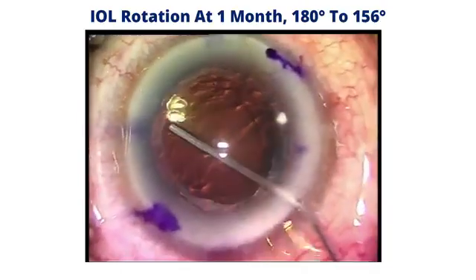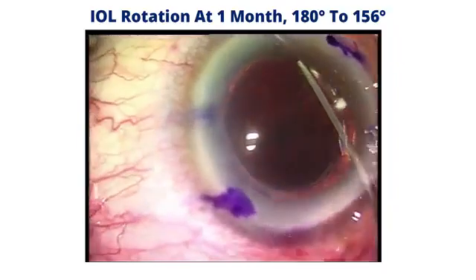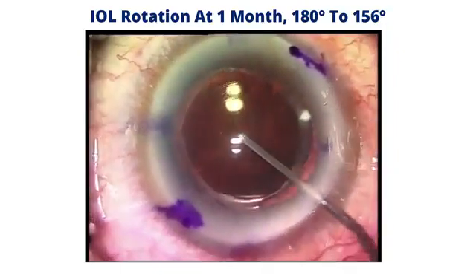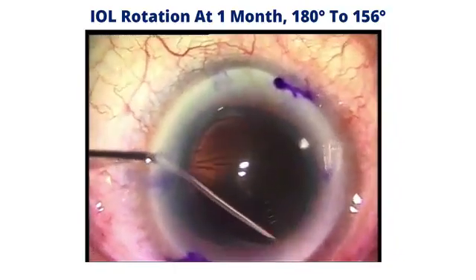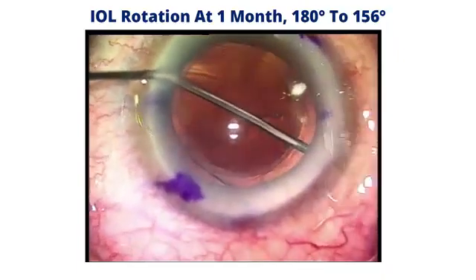It's an IOL that's rotated at 1 month, and you can see already some capsular fibrosis, and it's actually positioned at 180 degrees when intra-op it was actually left at 156 degrees. So you can see my 4 reference marks, and here I'm marking the 156 degrees that I intend to rotate it to.